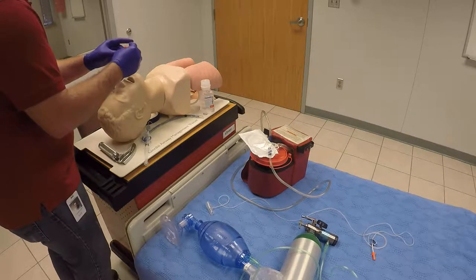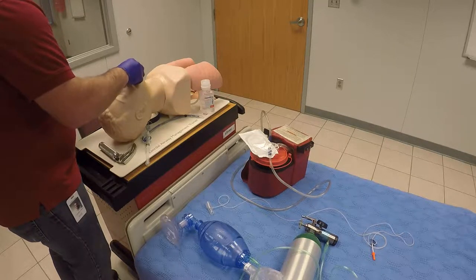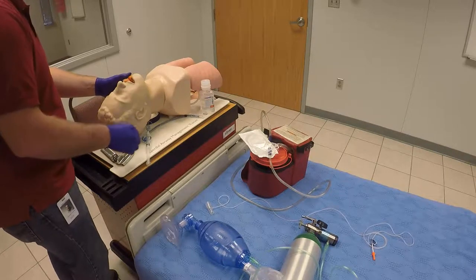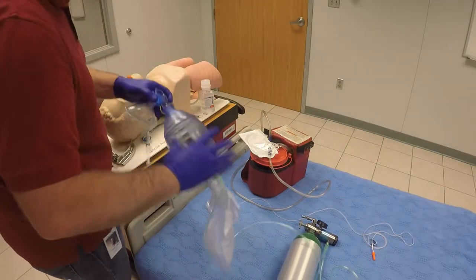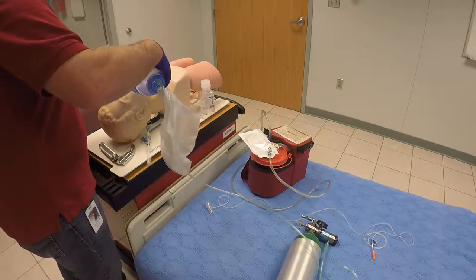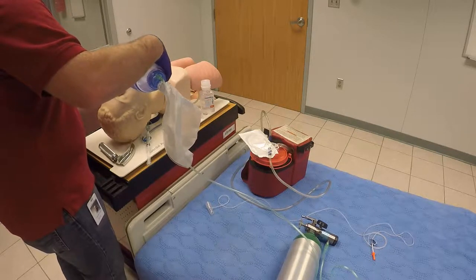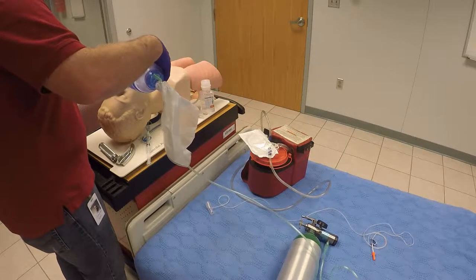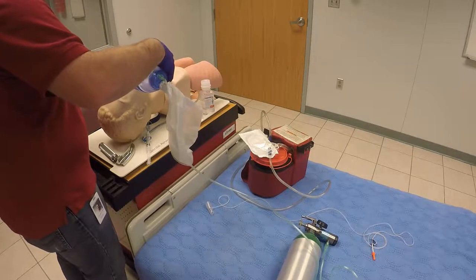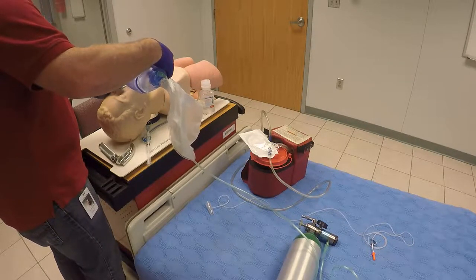I'm going to take my OPA and insert it in, noting any gag reflex and making sure I have an absence of gag reflex. I'll take my BVM — of course attached to high flow at 12 to 15 liters per minute — get a good mask seal, and begin ventilating the patient at 10 to 12 breaths per minute, which is one breath every five to six seconds, checking for good chest rise and fall and good lung compliance.